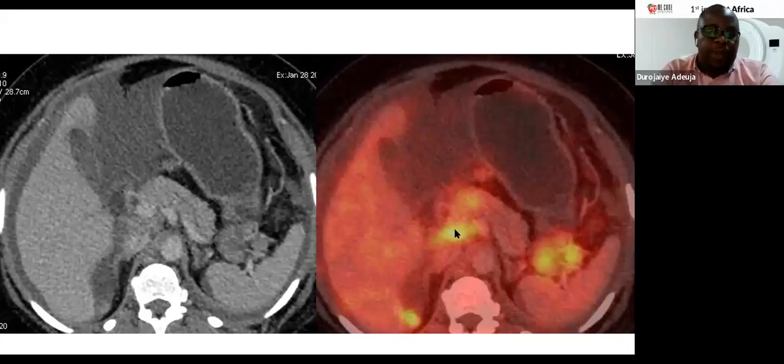And in this region of the peripancreatic area, I also appreciate this, despite the fact that this is appearing hazy and not so specific. This is another peritoneal lesion, so small, almost sub-centimetric, and with moderate enhancement, which is, however, demonstrating increased uptake, as you can appreciate on the fused image to our right.